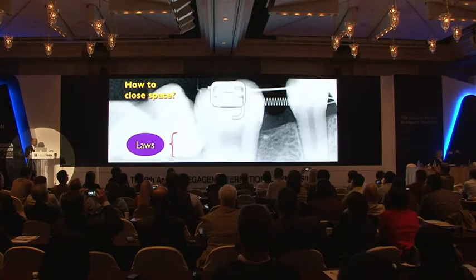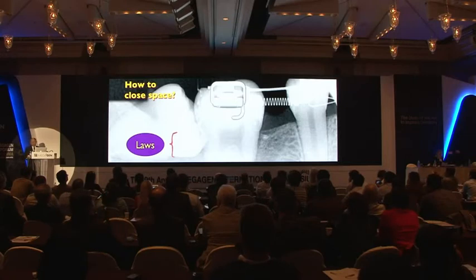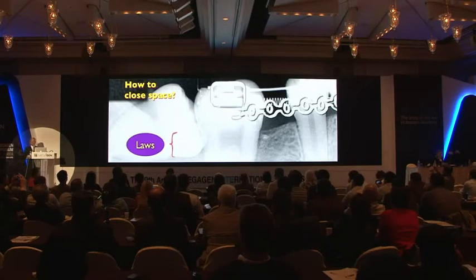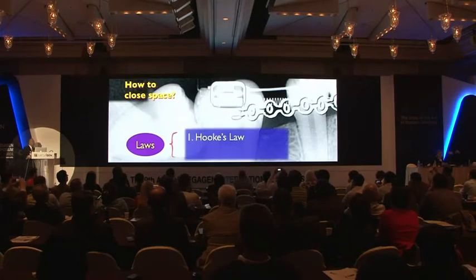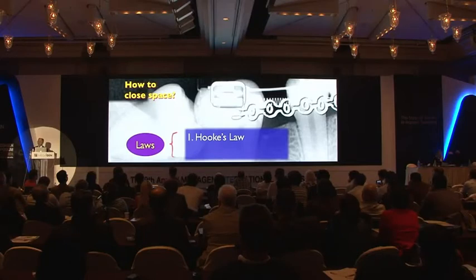So with that, how to close the space? The mechanic I use actually is very simple, that I believe everybody in this room will be able to do. I almost always use power chain. It's an elastic chain. So with this chain, because it's elastic, it produces a force. So it will be able to drive these teeth together to close the space.